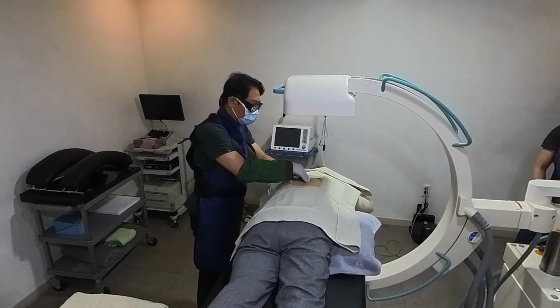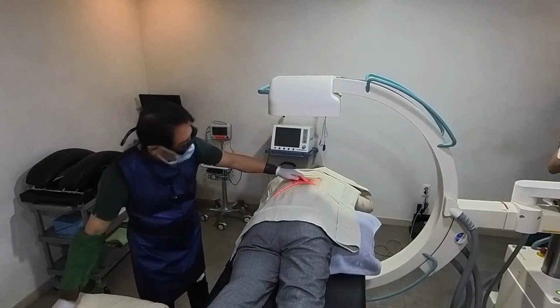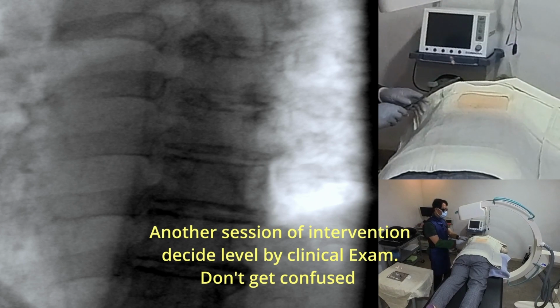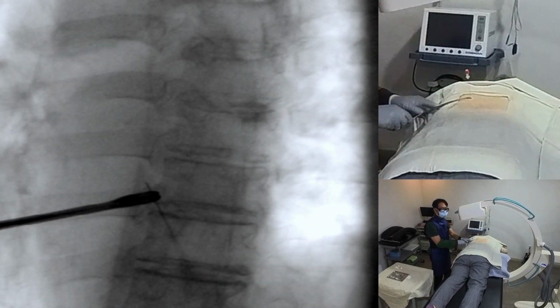Second, there is limited working space. The smaller size of the thoracic foramina and the proximity of adjacent structures can limit the working space for the needle, making it more challenging to safely and accurately position the needle tip.